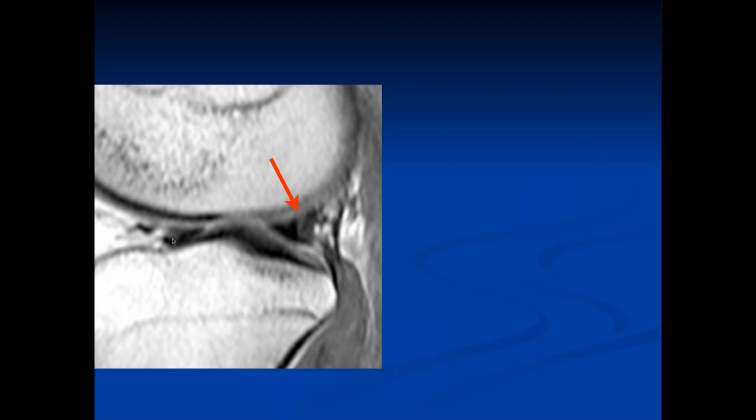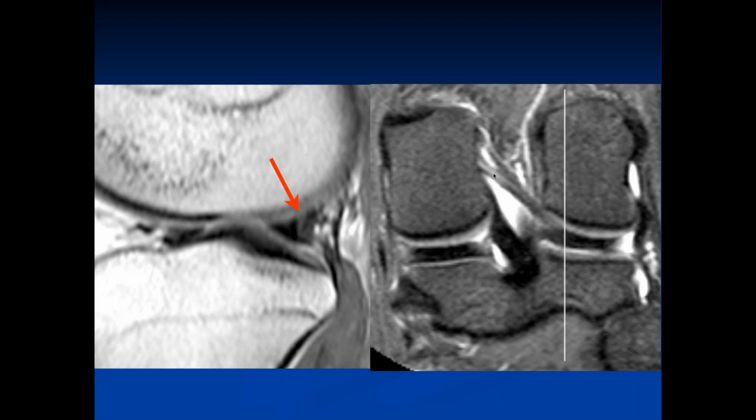That looks like some abnormal oblique signal there. So this is a pitfall. I mean, it could be a vertical tear. What else could it be? Could it be the capsular ligament coming off there? Well, it could be Wrisberg's ligament, which comes across back here, and if you cut the posterior horn of the lateral meniscus right where Wrisberg's ligament comes in, you can have a little bit of fold between the two, which can look like increased signal intensity.